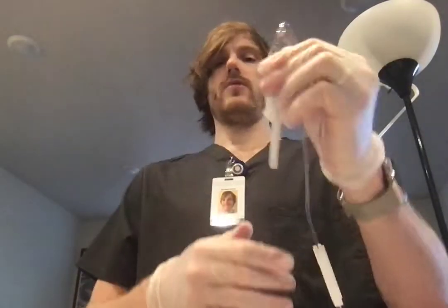And then you have your chamber, which you would fill up and purge, or squeeze to fill this thing up with fluid. And then you have the spike, which is very sharp at the top, which you use to puncture the IV medication.